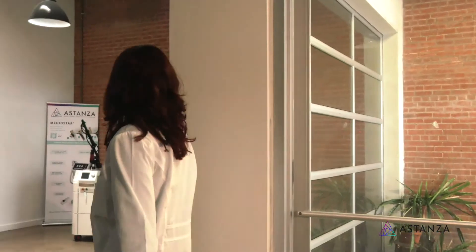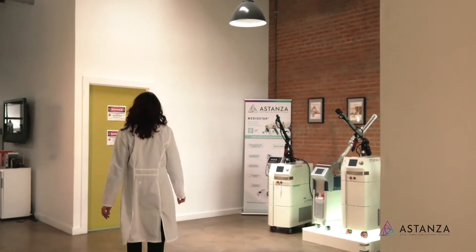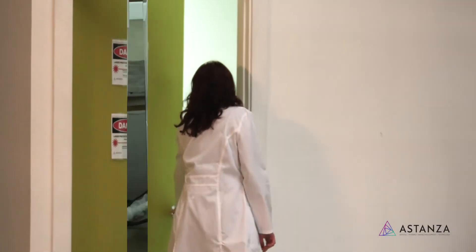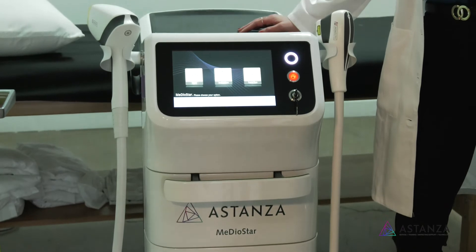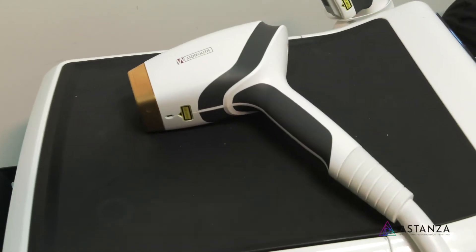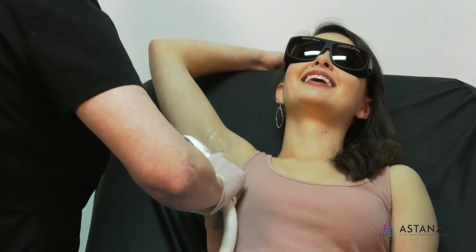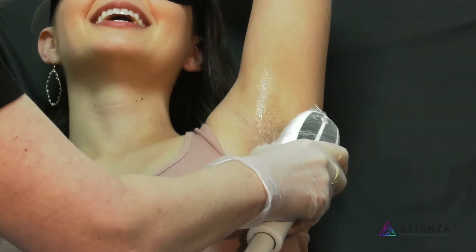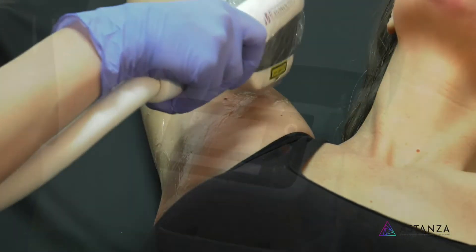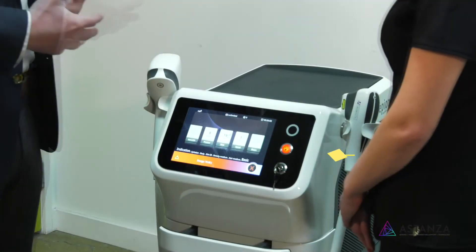As an RN with six years of working with various hair removal lasers, I've been frustrated with how long the treatments take and how painful they can be. It's nice to see a laser like the Aslepion Mediostar from Astanza address each of these issues and finally design a laser that practitioners want to use. Patients love it as well — it's fast, pain-free, and does a great job.